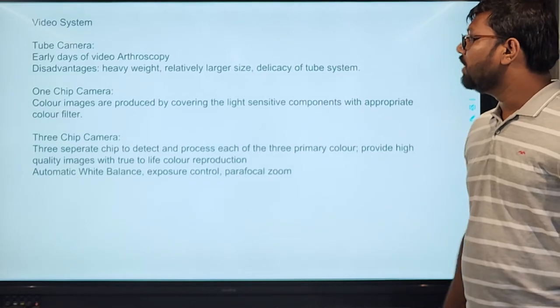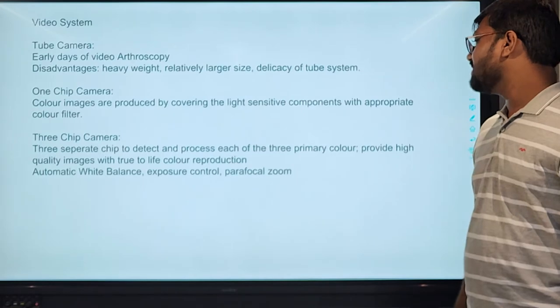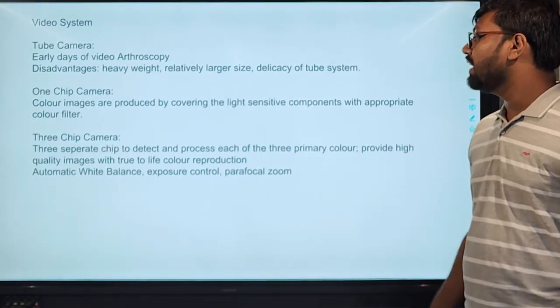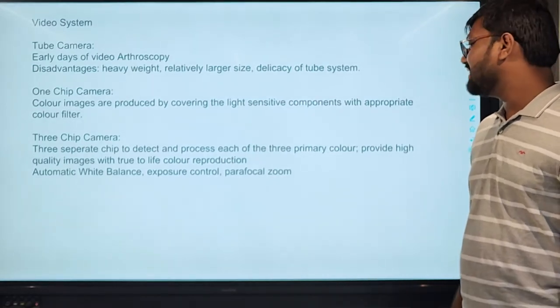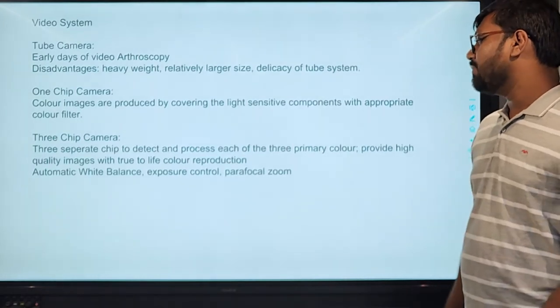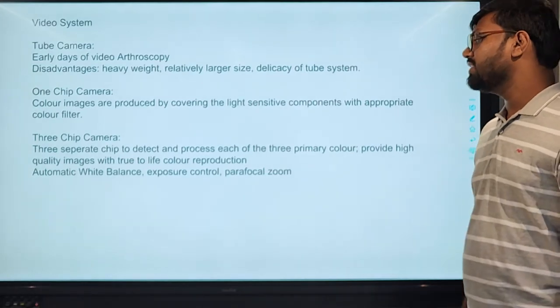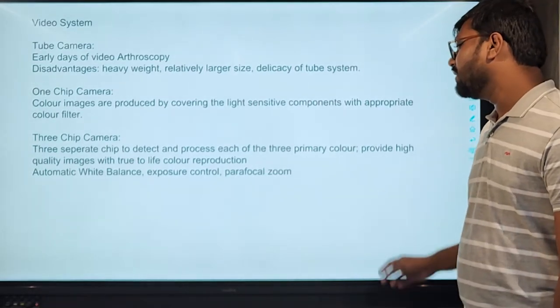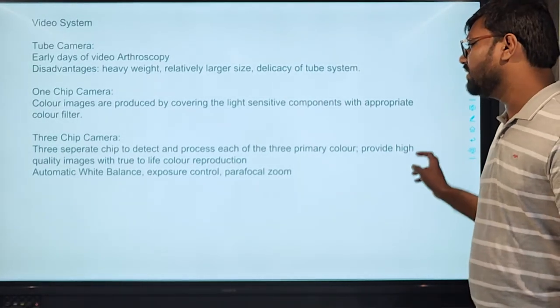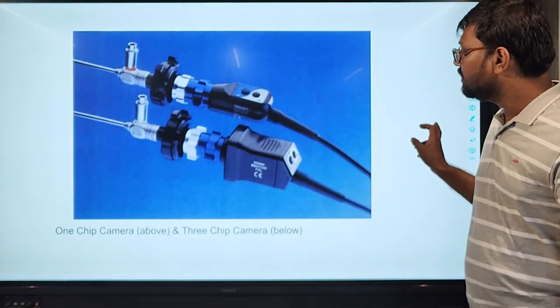Early days video arthroscopy were using tube cameras. Disadvantages are very heavy and relatively larger size and delicacy of the tube system. The one chip camera and three chip camera. One chip camera, color images are produced by covering the light sensitive components with the appropriate color filter. And three chip camera, three separate chips detect and process each of the three primary colors and provide high quality images and a true lifelike color reproduction. The automatic white balance and exposure control and the parafocal zoom are other features of the three chip camera. The first one is the single chip camera and the second one is the three chip camera.